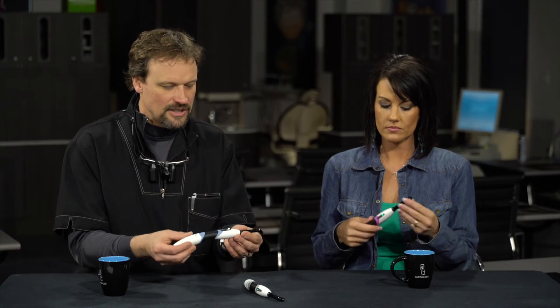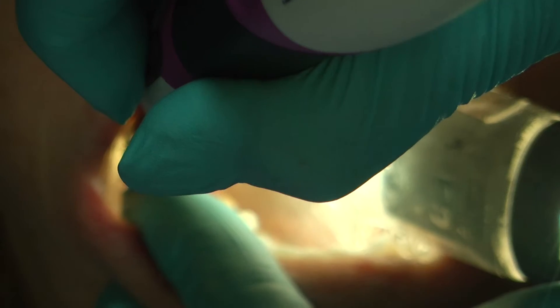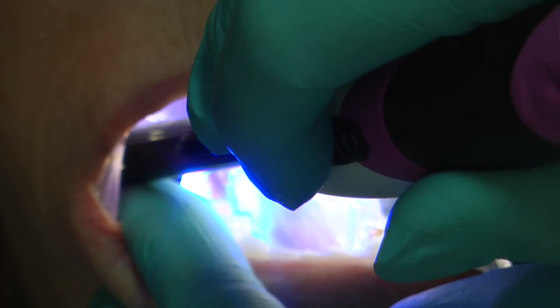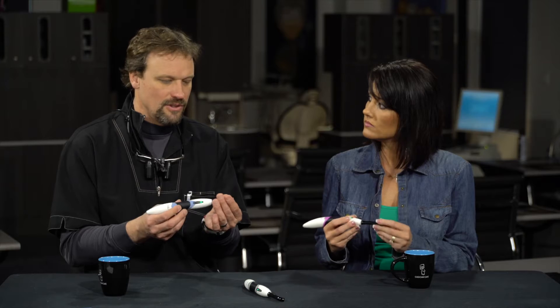When we're using the lights, one of the things I really like is the ergonomics. You can hold it at many different angles and styles, and the tip rotates 360 degrees, which is easy. When you're working in the very back of the mouth, sometimes it's the tip that gets in the way, but this small tip really bends the light extremely well so you can get it wherever it needs to go.